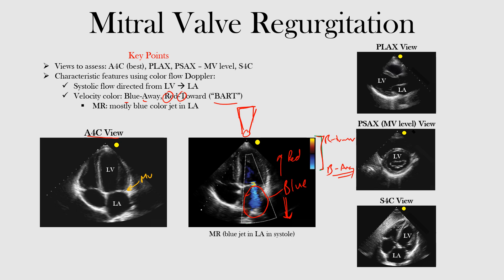Because we have a blue color occurring during systole — as the left ventricle is contracting — blood is coming back into the left atrium. That's what we expect to see with mitral insufficiency or mitral regurgitation: most of that color jet in the left atrium appears blue during systole. The systolic flow is directed from the left ventricle back to the left atrium.